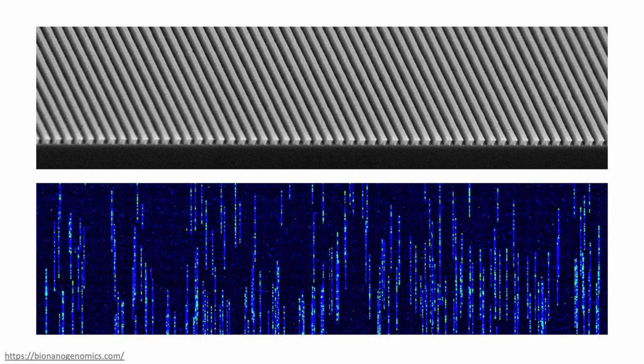So this is what the nanochannels look like. The DNA segments will be passed through it. So there is no copying, no PCR, no enzymatic reaction, nothing. It's just a very simple method in principle. And they will start imaging those DNA segments as they pass through it.